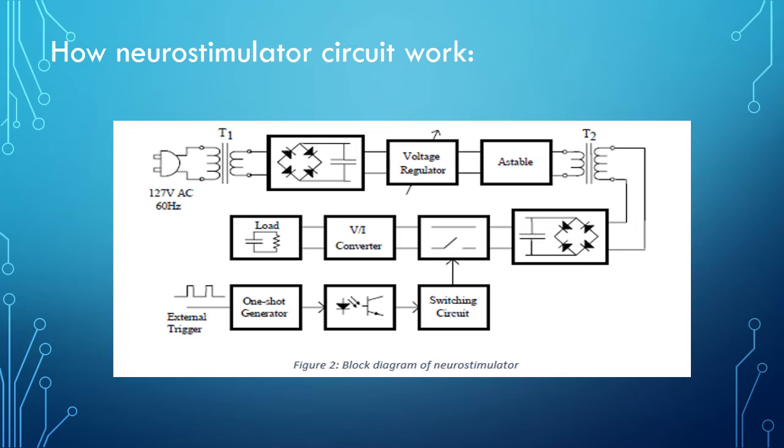Some of them are very advanced, and we are not interested in them here. For this block diagram, the load represents the electrode skin interface resistive and reactive components, as well as the bulk tissue resistance. Pulse repetition rates range from 1 to 10 times per second.